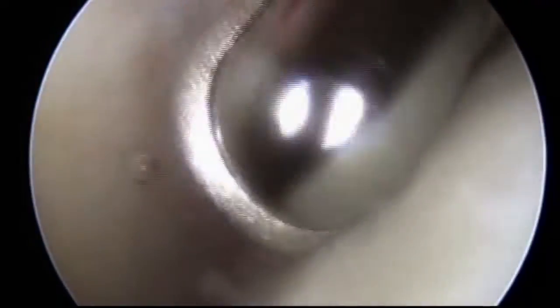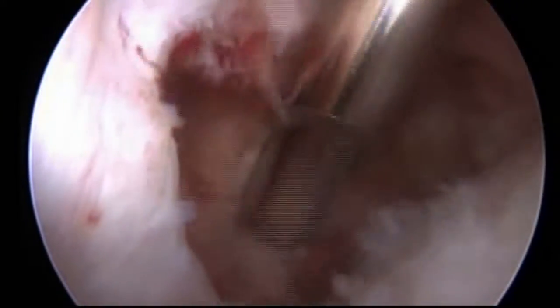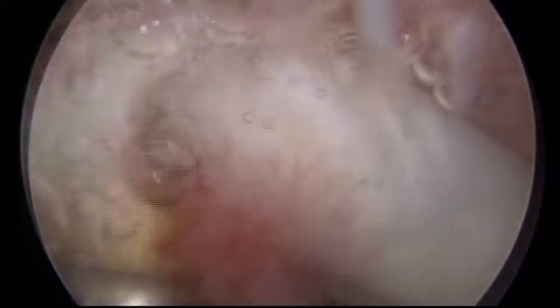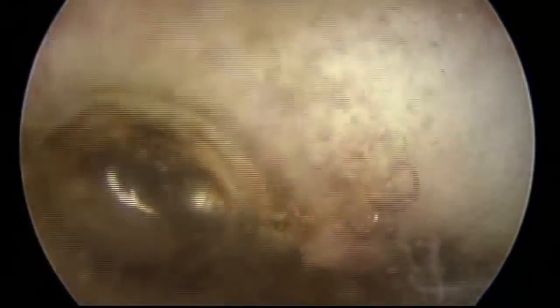Unstable glenohumeral articular cartilage, degenerative labral tissue, and synovitis are debrided to a stable border with an arthroscopic shaver. The long head of the biceps tendon is released using radiofrequency ablation.